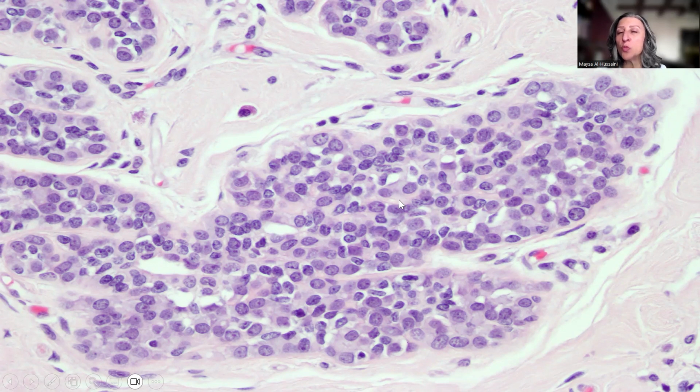Extremely important small tip that might help to suggest the diagnosis of lobular carcinoma in situ. Another small tip, as if this is a signet cell appearance of the tumor cells. Remember that sometimes lobular carcinoma cells, whether invasive or in situ, can show this signet ring morphology. Again, a small hint to the diagnosis.